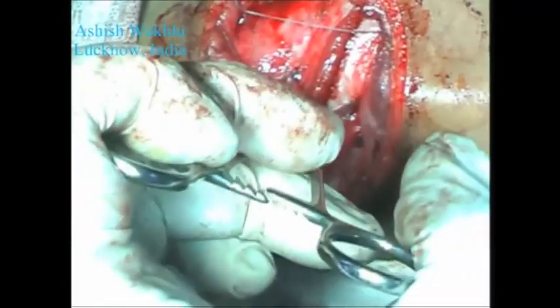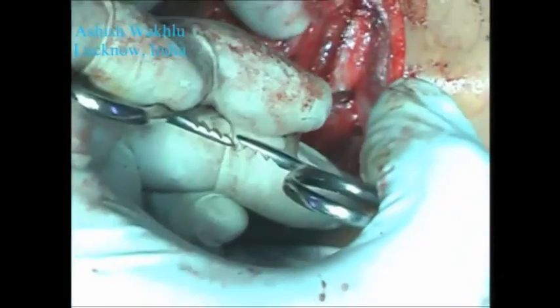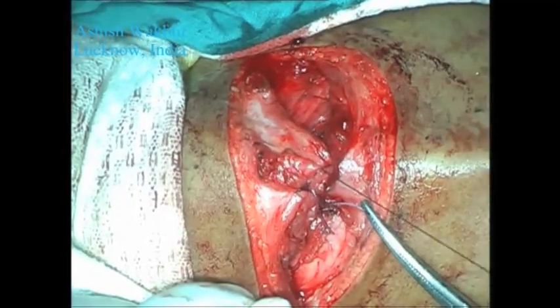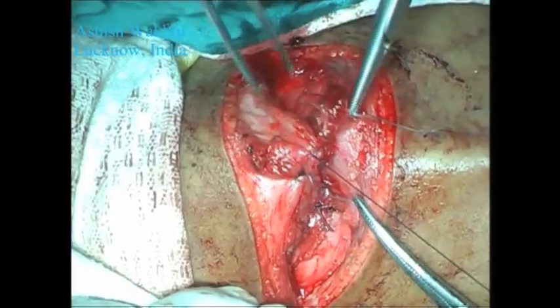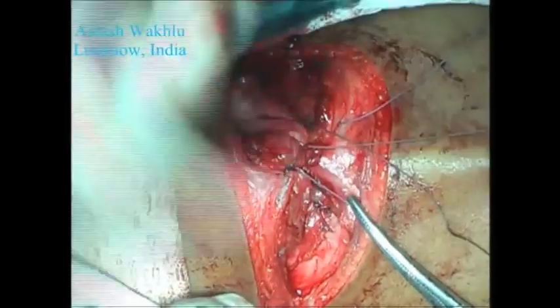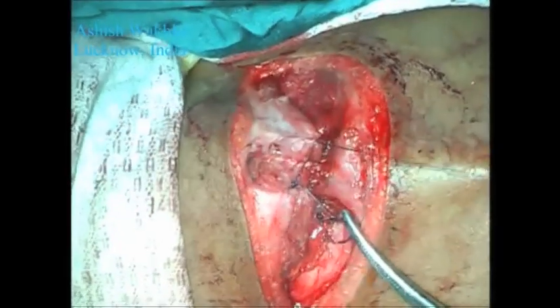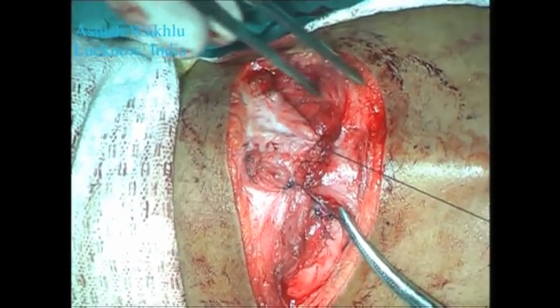A pair of Alice's forceps are being used as a rib approximator while the three sutures closing the intercostal gap are tied off. Closure of the serratus anterior and latissimus dorsi muscles is being done by continuous over and over interlocking sutures of 2-0 polyglactin.